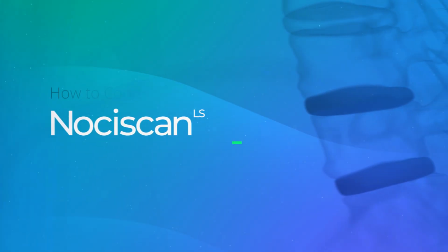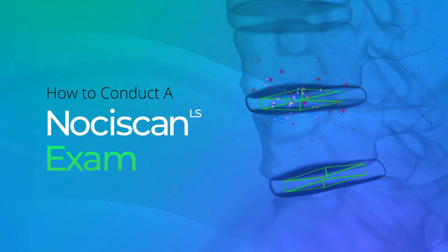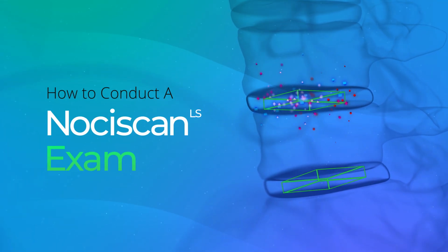Welcome to the Nociscan Training video. This video will walk you through the process of performing a Nociscan exam for chronic low back pain.